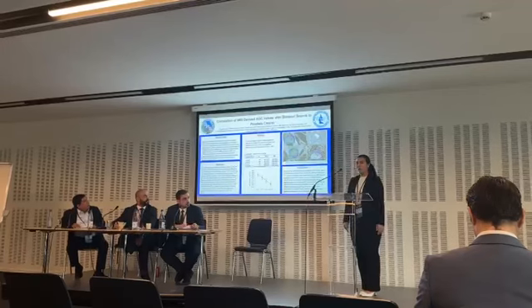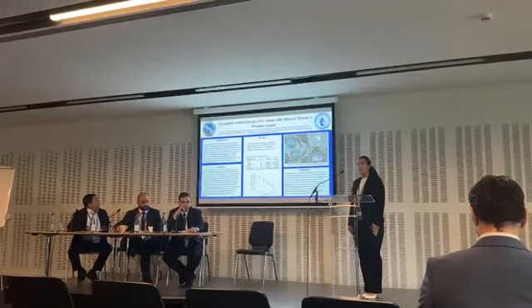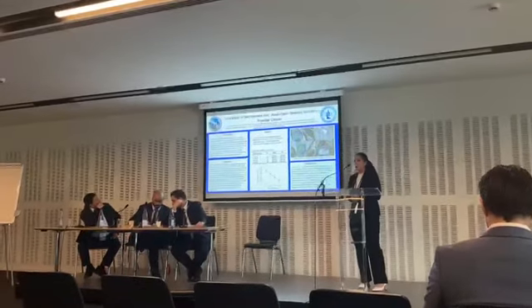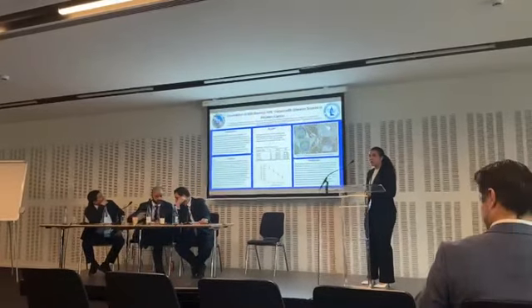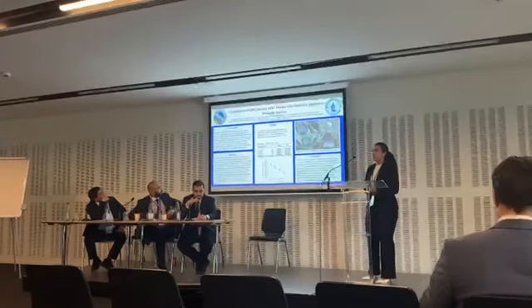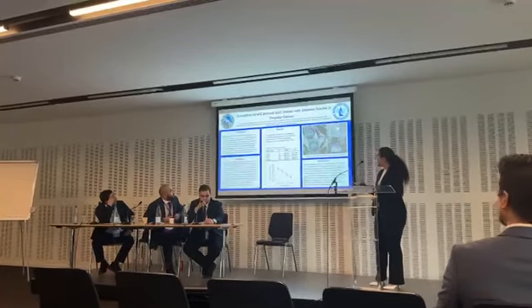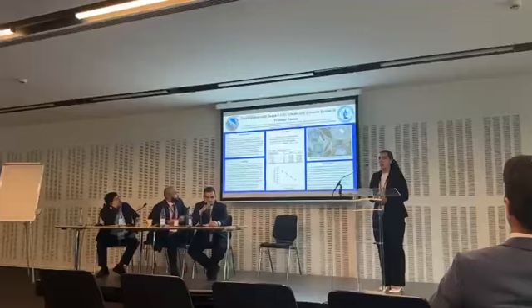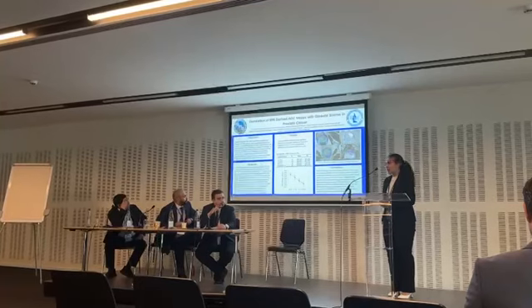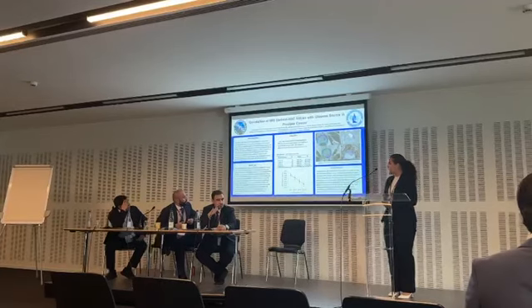I'm from Gainesville, Florida, and I'll be presenting my project on the correlation of MRI-derived ADC values with Gleason score in prostate cancer. As you well know, PI-RADS scoring has been widely used to assess suspicious prostate lesions, but it is a qualitative means of assessing those lesions, and it can be susceptible to interobserver variability. On the other hand, apparent diffusion coefficient, ADC, a value that's derived from the diffusion-weighted image on MRIs, is a quantitative means of assessing tumor characterization.